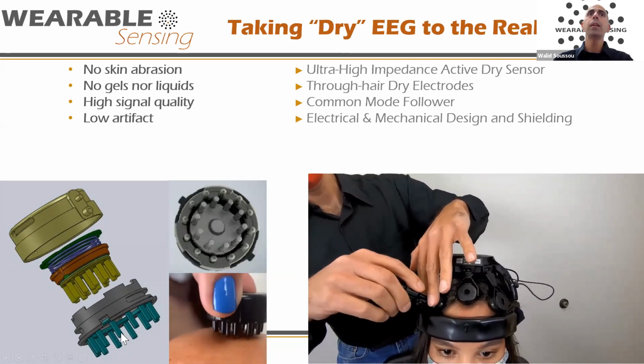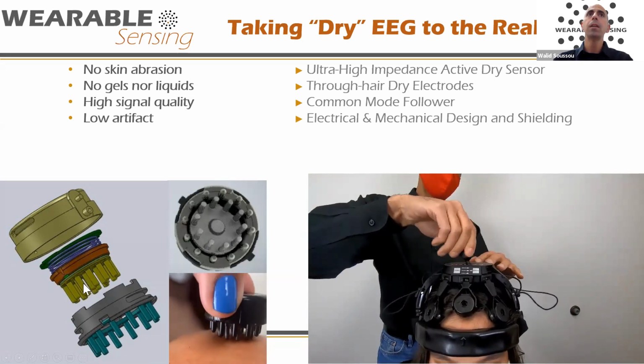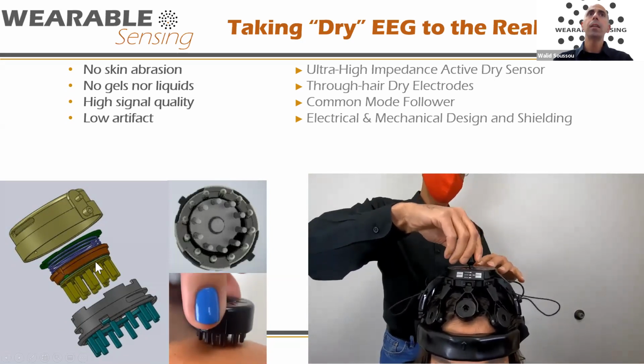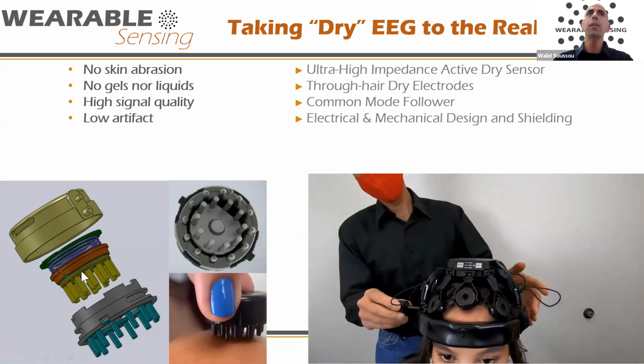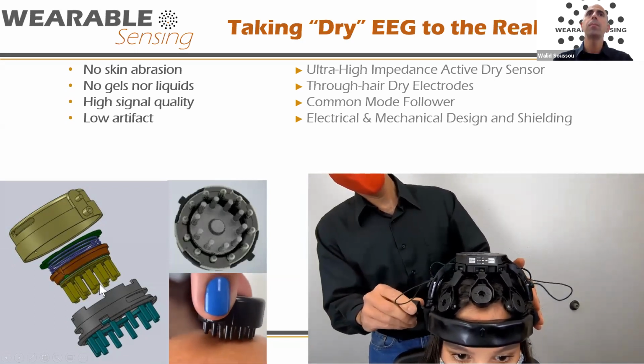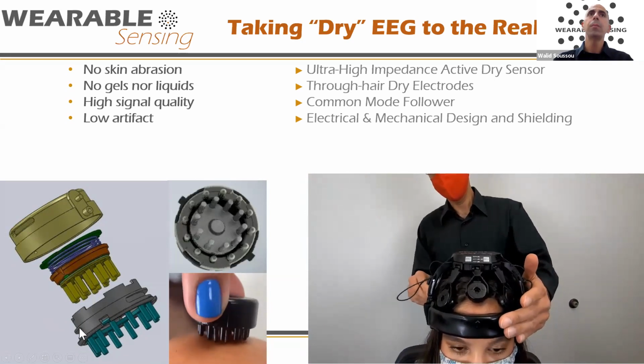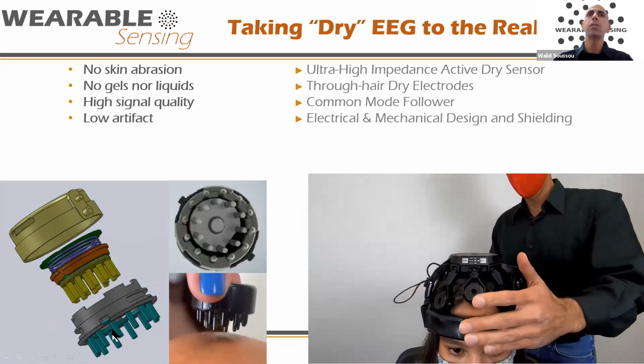The only remaining opening is the bottom side, which is where the head is and where, therefore, the EEG signals are going to come in. So this electrode and the amplifier are going to pick up only EEG signals, amplify them, and then send them out to the digitizer downstream. That helps us deal with electromagnetic interference coming from the outside, being blocked by the Faraday cage.